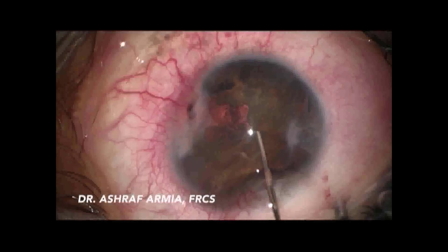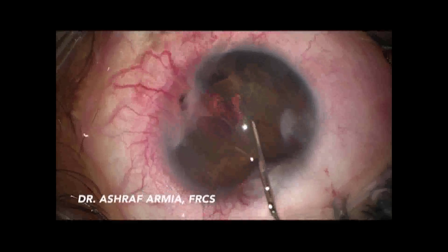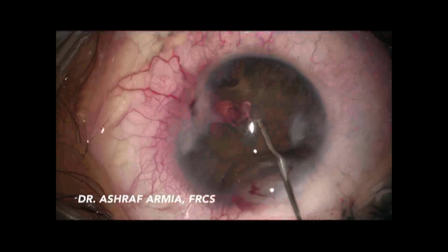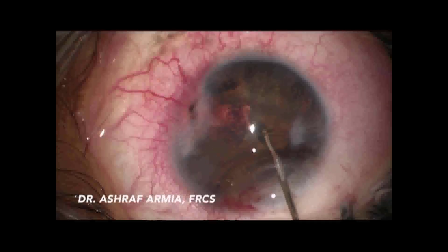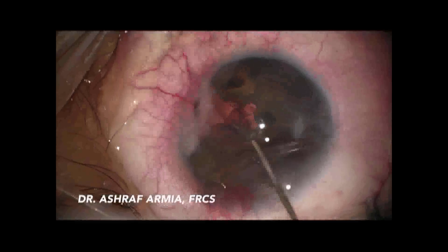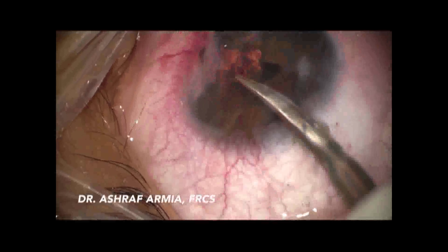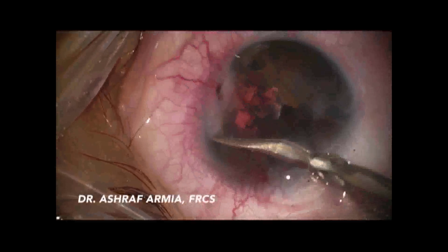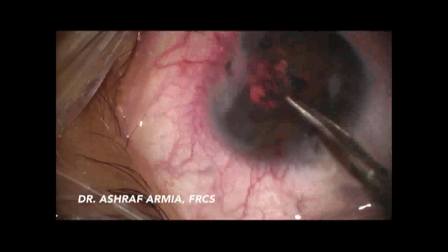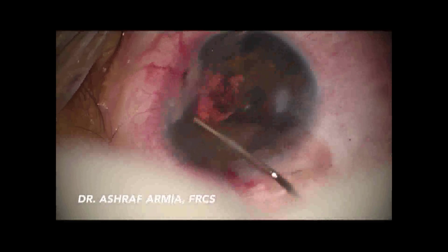I decided to open a 2.4 mm incision to help me dissect the iris tissue from the foreign body. A lot of viscoelastic was used during the dissection to protect the cornea and to bluntly dissect with the cannula. Then I entered a special anterior segment scissor, performing blunt dissection of the iris tissue from the foreign body and cutting more adhesions. More dissection was done with the Sinskey hook, with careful attention to the cornea.